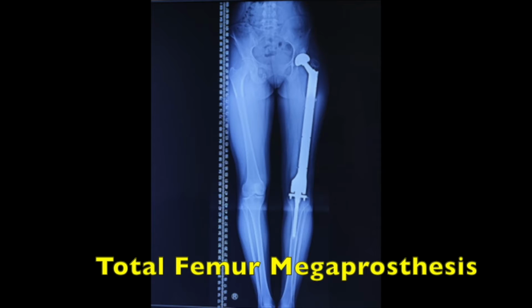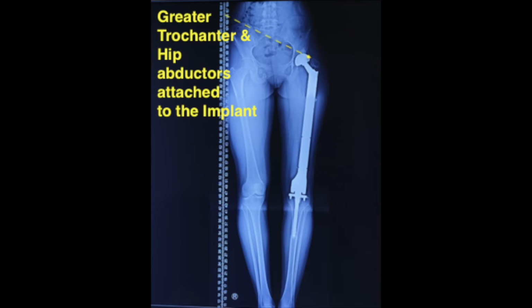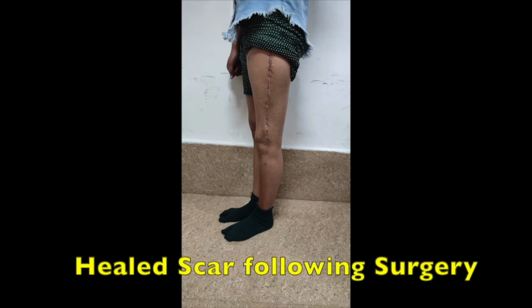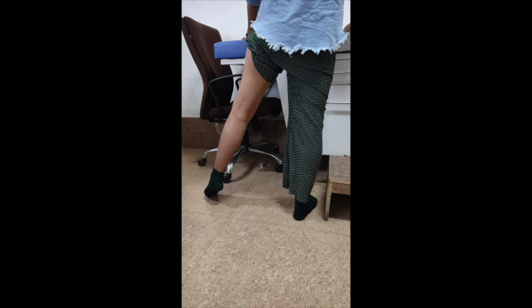Following this, we will be seeing what is the functional outcome of the patient following this complex hip, knee and thigh bone replacement surgery. So in this case, the greater trochanter and abductors were attached to the implant. We can see here the healed scar following surgery, and the patient is able to stand, bearing complete weight on her legs. The patient can do abduction and adduction at the hip joint.